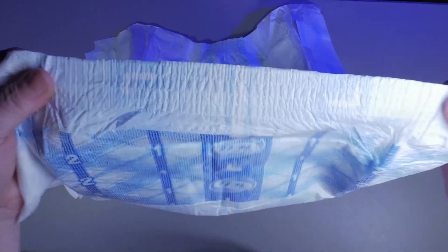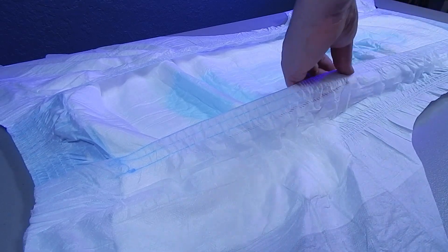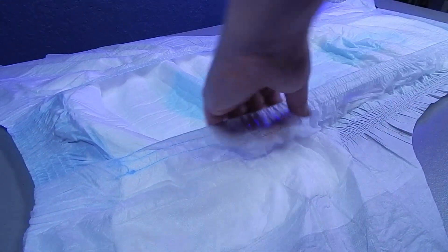This product has elastic leg gathers and front and rear elastic waistband, which allow for a good comfortable fit. This product also has large full-length standing leak guards to aid in leak prevention. This stands out as one of the larger leak guards on the market.